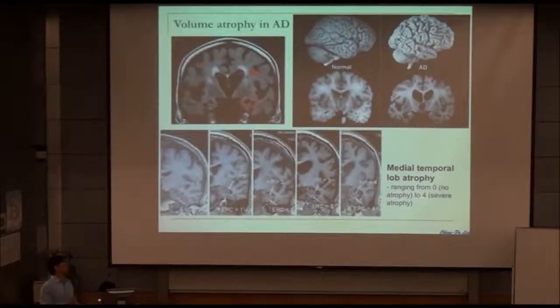And here is another example in Alzheimer's patients. You can see that in these patients, there is different atrophy in different brain regions. So based on such techniques and also the post-processing, we can identify the changes or even the progression, I mean, following the onset and duration, and what the volume changes are. So that's the basic idea for us to use such techniques.